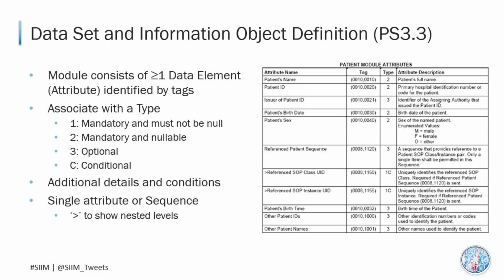I can see that you grew up in the age of XML and JSON, where each attribute is generally a human-readable string. DICOM Web supports this using the DICOM keyword defined in Part 6. Many DICOM toolkits also help you process DICOM objects without having to memorize the DICOM tags. With this said, knowing a bit of the tag helps you understand DICOM.